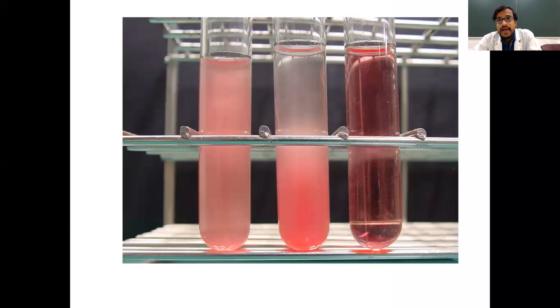After that, we'll keep the test tubes aside for incubation. You know what incubation is? Incubation is providing the reaction a specific temperature at which the reaction is completed comfortably. Okay, that is incubation. For some reactions, the incubation is at room temperature, for which we'll keep the test tubes aside. For some reactions, the incubation temperature may be 100 degrees, in which case we'll keep the test tubes in a boiling water bath. So after adding the reagents and samples, we'll keep the test tubes for incubation, whether at room temperature, 50 degrees, 60 degrees or 100 degrees. Okay, so the first step is pipetting. After that, incubation. You have done all these, so you can follow it easily.